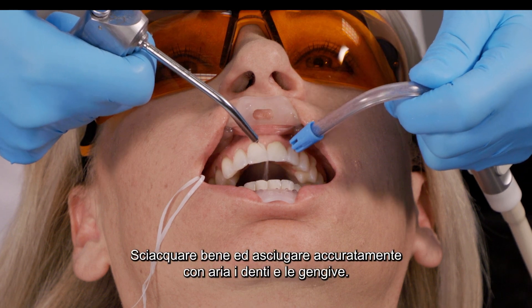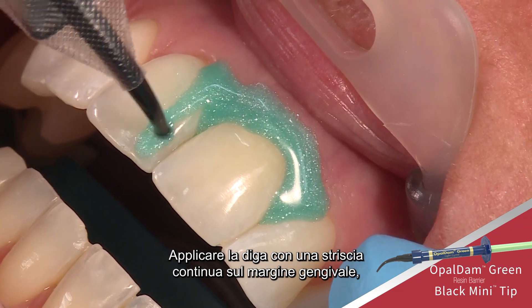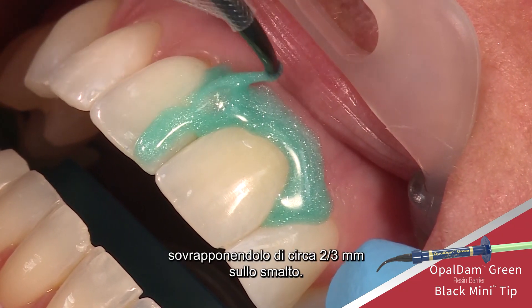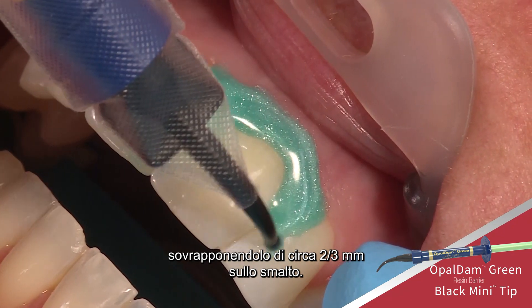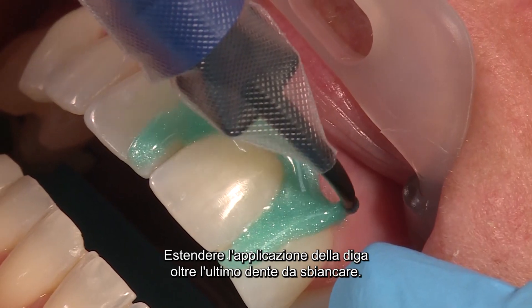Rinse and air dry the teeth and gums thoroughly. Express a continuous bead of Opal Dam barrier along the gingival margin, overlapping approximately 2 to 3 millimeters onto the enamel. Extend the resin one tooth beyond the last tooth to be whitened.